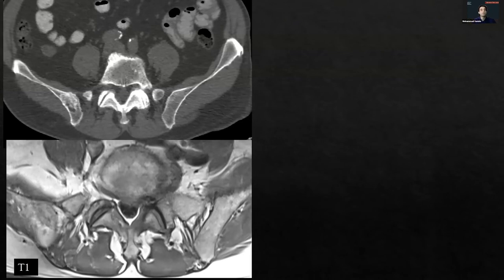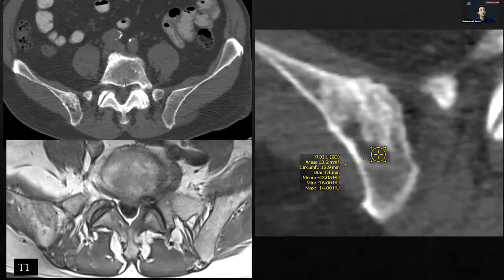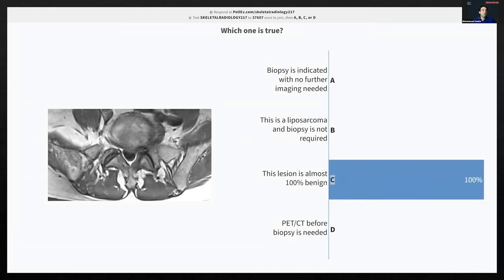Here is another case: a lesion in the right iliac bone, predominantly sclerotic, shown on T1 and CT. There is an area with a little different signal and density on CT. The ROI Hounsfield unit reads minus 43. The question is: which statement is true — biopsy is indicated with no further imaging needed; it is a liposarcoma and biopsy is not required; the lesion is almost 100% benign; or PET CT before biopsy?